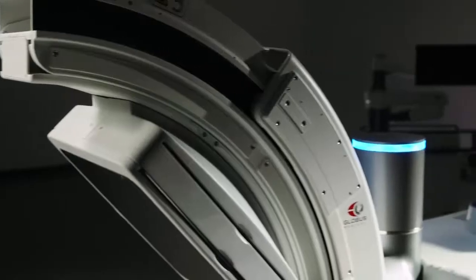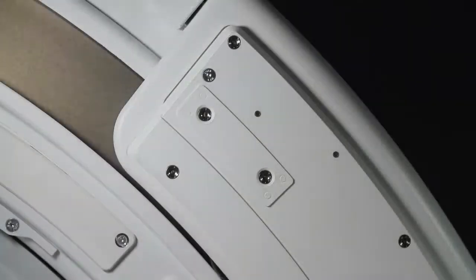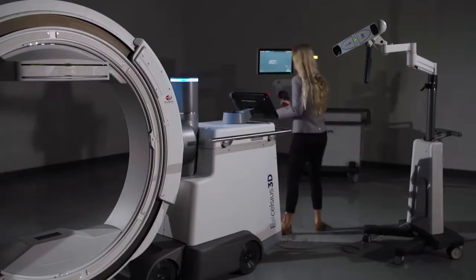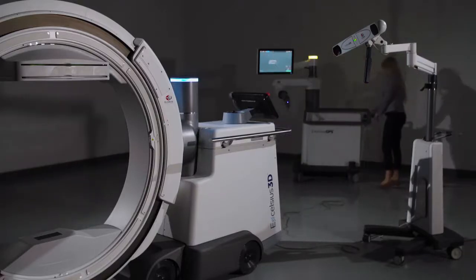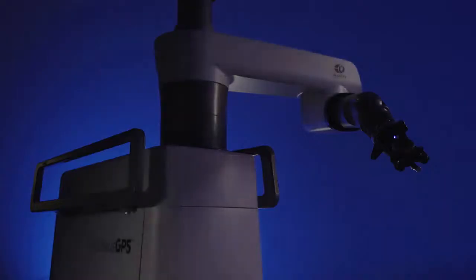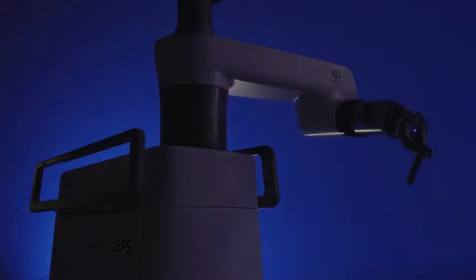Excelsius 3D functions as an elite standalone imaging unit, but it can also serve as an elegant extension of the Excelsius ecosystem. Due to the two integrated navigation arrays on either side of the gantry that incorporate active LED tracking, any Excelsius 3D image can be automatically registered and transferred to Excelsius GPS. This accelerated automatic registration eliminates the need for the ICT and fluoro registration fixtures when navigating with Excelsius GPS.